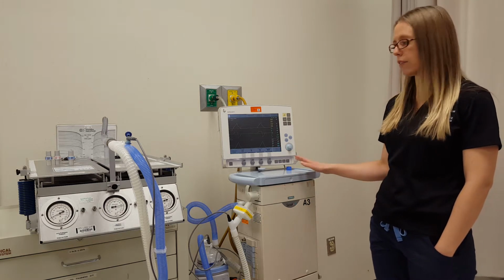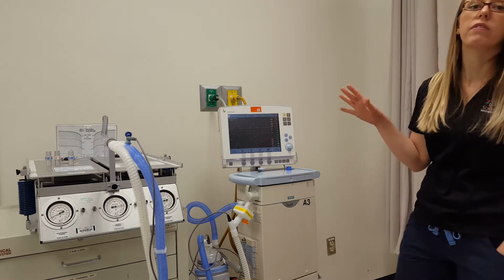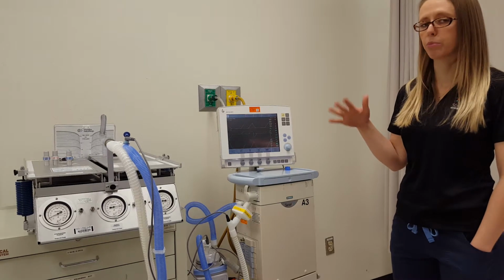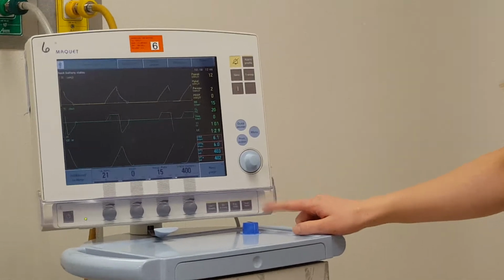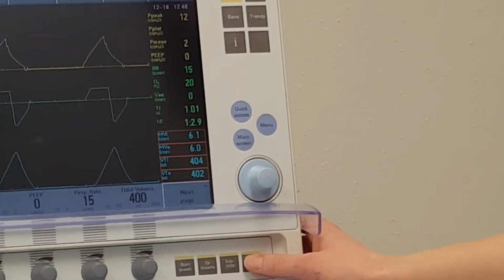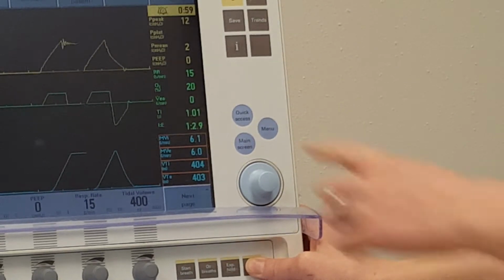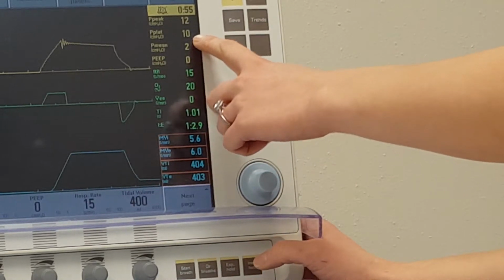Okay, so one thing we haven't really talked about is plateaus. When we were talking in the first videos about compliance and Raw, we talked about PIP versus Plat. So in order to get a plateau pressure, we're going to do an inspiratory hold. Under here, there's a little inspiratory hold button. We can go ahead and compress that button, and we're going to see it's going to hold, and we can see what our plateau pressure is.